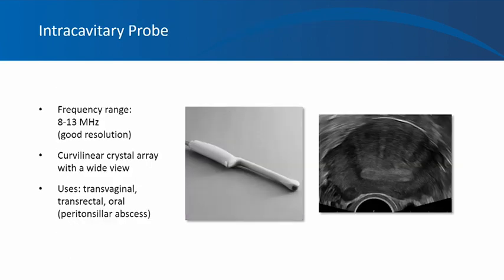This is the intracavitary probe. As the name suggests, it's used to scan from within the cavities, and it is a high-frequency probe and offers good resolution, and it is used to do transvaginal, transrectal, or oral scans.